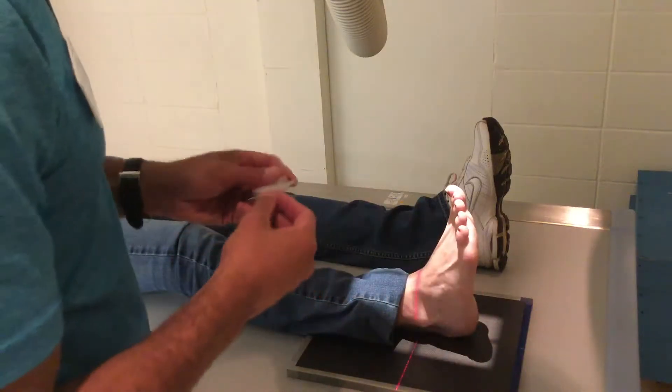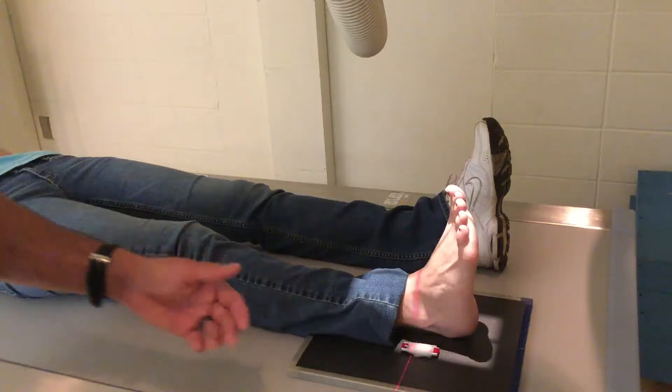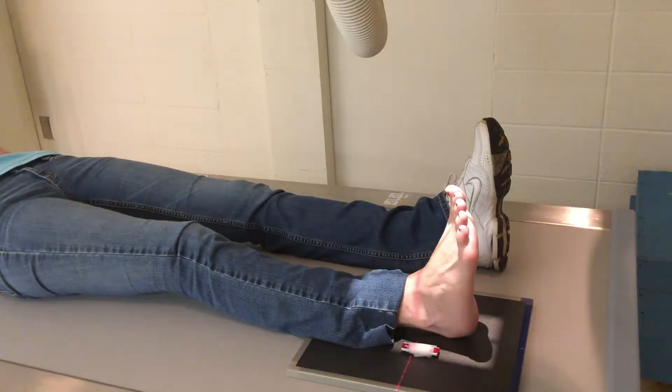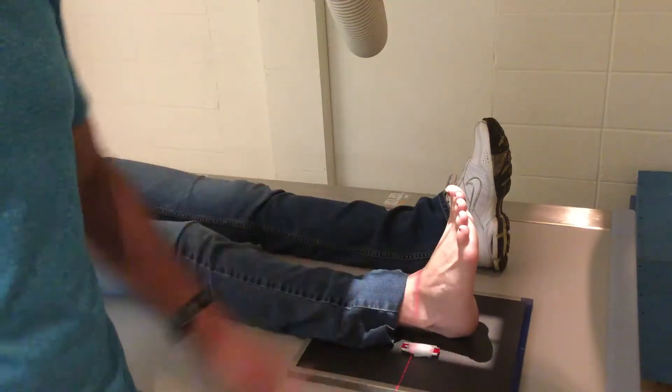I like to include the heel. Cone in, and then I mark laterally. The AP angle is pretty simple — not a lot to it. You're centered right in the middle. I know it's hard to see from this angle, but that's the AP.